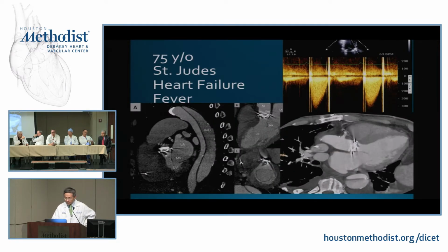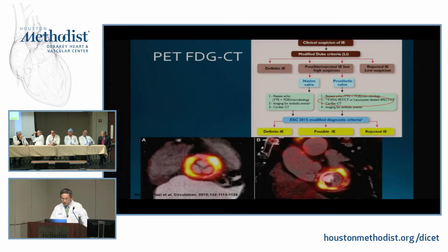And the other thing is, one of the things we use is that usually we look at a maximum intensity projection, which accentuates the high Hounsfield unit areas. But we can go to average or minimum intensity projection, what we call mini MIP, which enhances the lower attenuation parameters. And that really helps sometimes to see things more clearly.